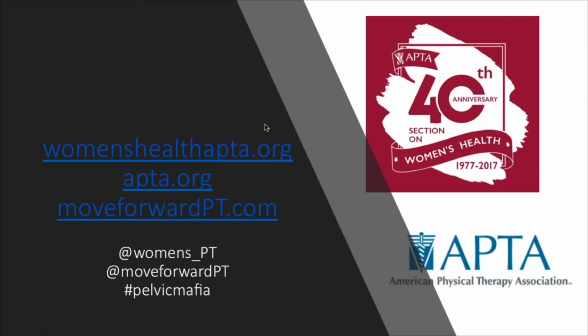And I would agree. I typically will use it in my initial assessment, which becomes patient education. And I've had a really fun time alternating back and forth. Some patients I may do an internal assessment first and then follow it up with ultrasound and see if I can correlate the findings, and sometimes I might swap it if I have a patient that may not necessarily tolerate the internal exam or be interested in that.